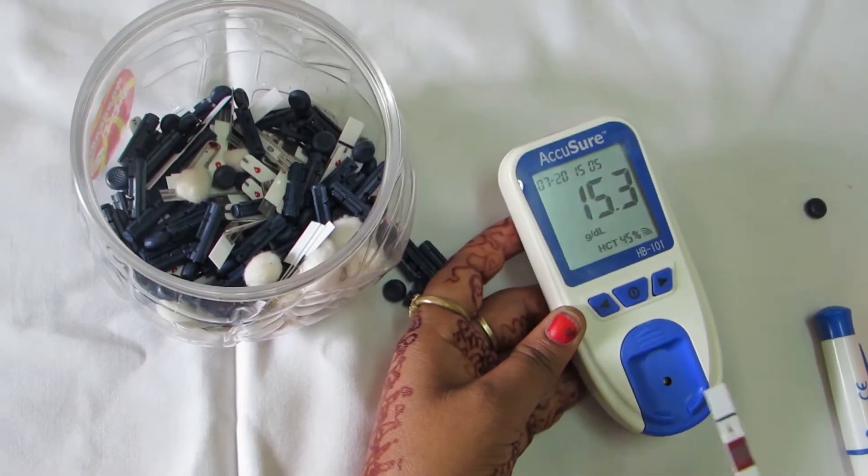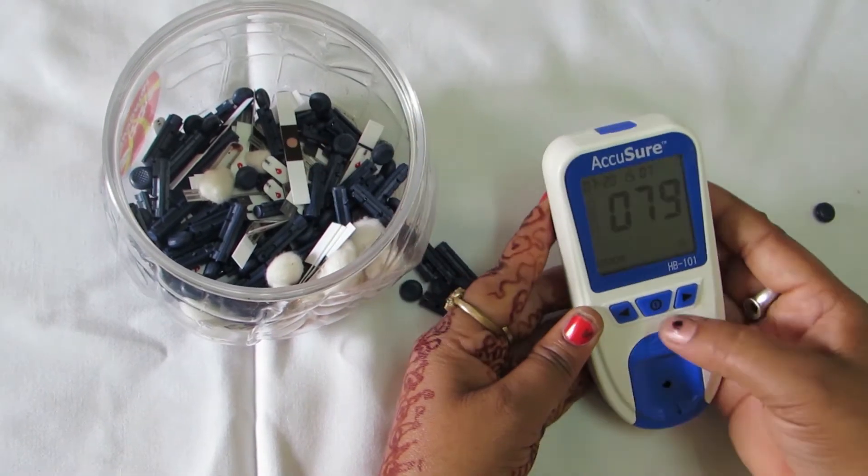Disposal of Haemoglobin Strip. Take out the Haemoglobin strip after the test and drop it in the waste disposal box.